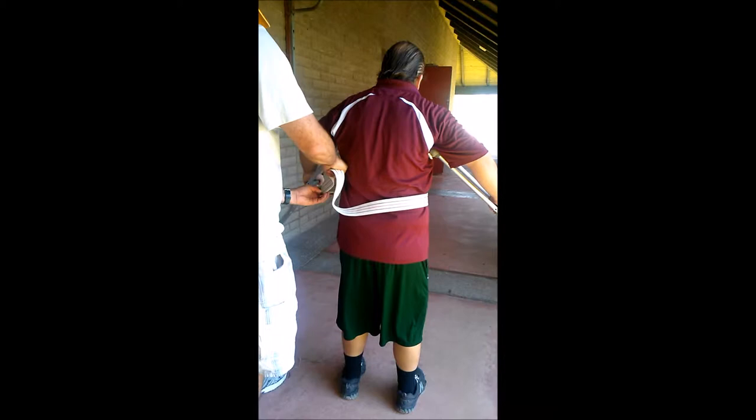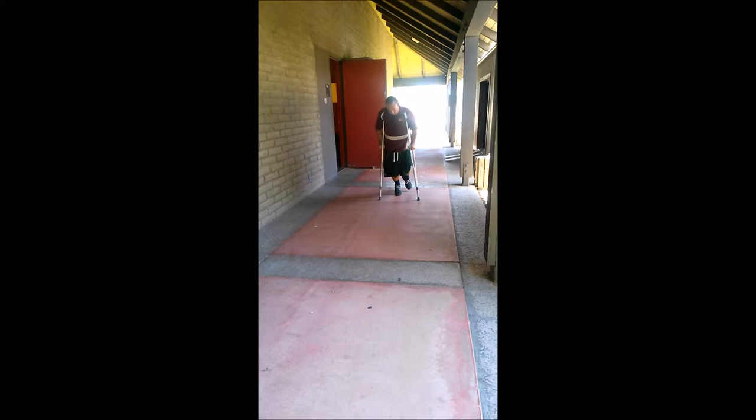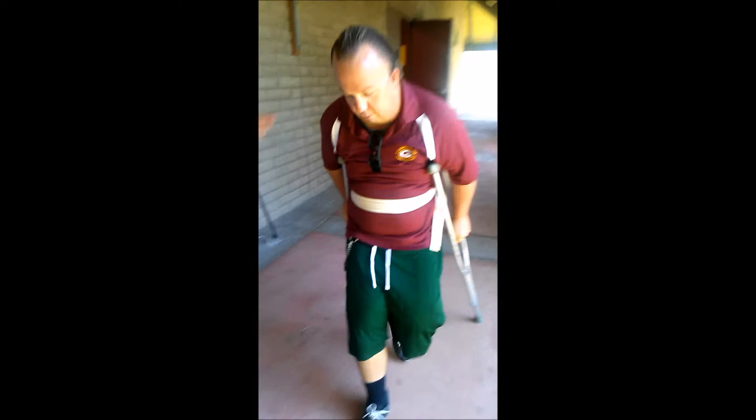John, I'm going to coach you through some different types of gait. Go ahead and walk with the crutches. That's an interesting pattern - not sure that's orthodox. Now, pretend your left leg is the bad leg and swing it through - don't let it land on the ground. There you go, swing through. That's a swing-through gait.